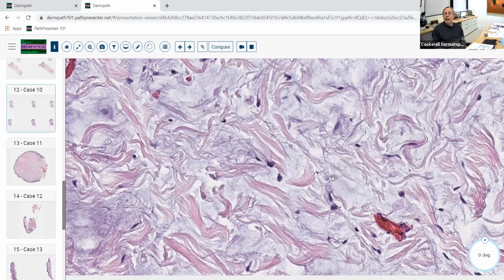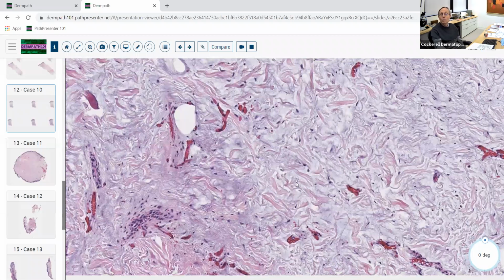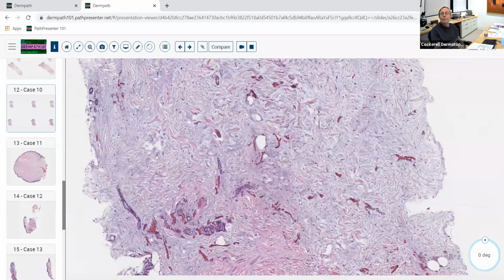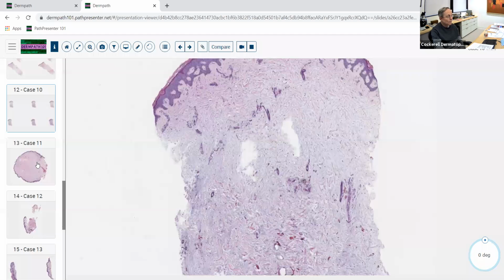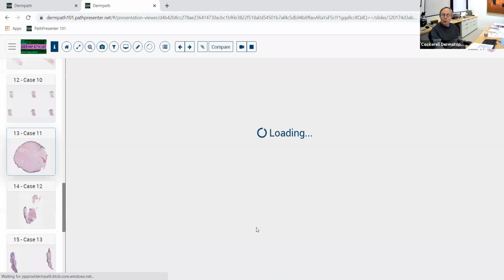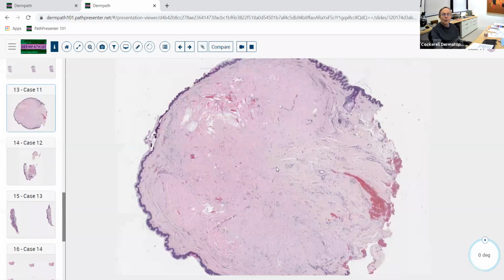Probably the long-acting thyroid stimulator comes in and causes these fibroblasts and mast cells to produce all this massive amount of mucin. It's not circulating in the body and depositing here. It's being produced here. So it's local production of mucin, but it's being stimulated by a host response, probably the abnormality associated with Graves' disease and the long-acting thyroid stimulator antibody that gets produced here. So that's pre-tibial myxedema. Here's another disorder of collagen and elastic tissue, and it's a shave biopsy of this big, thick nodular lesion.